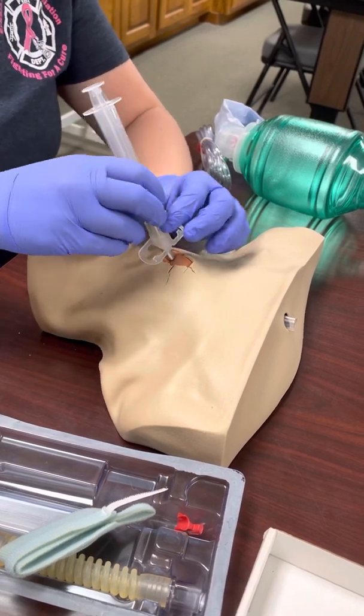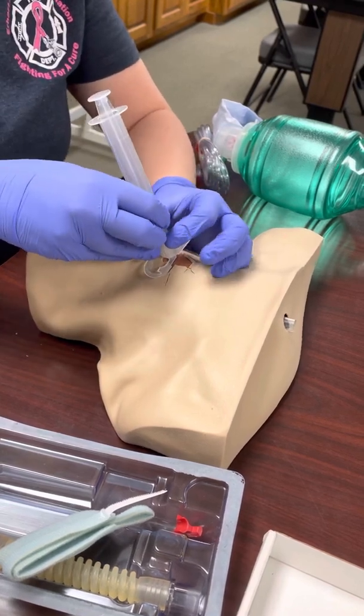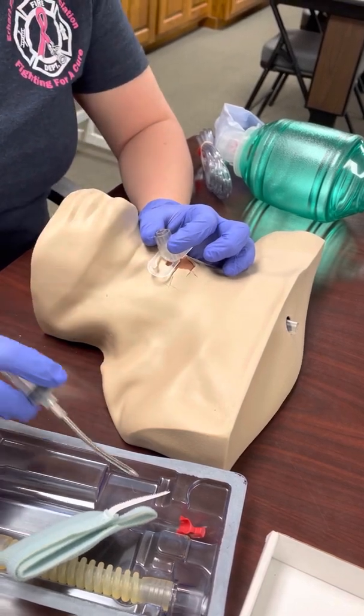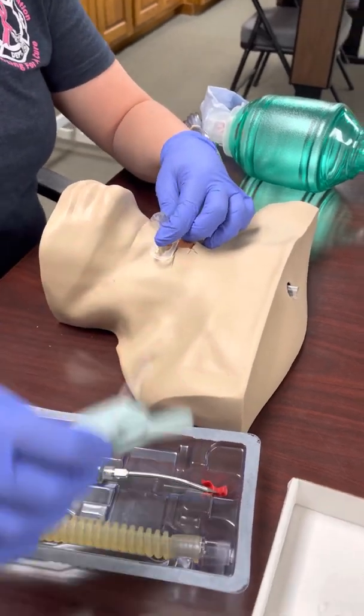Once you've confirmed you're in the trachea, go ahead and insert the plastic piece forward. It's a little hard on the plastic mannequin, but as you pull it forward you're going to pull the needle catheter out. The needle does not advance any further — from here you're just going to advance that plastic piece.